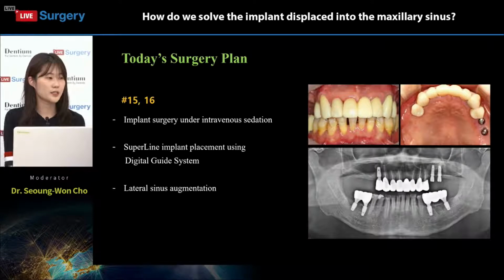So, when it comes to today's surgical plan, Professor Byun will be placing implants for tooth number 16 and 15 under intravenous sedation. In this case, superline implant from Dentium will be used using digital guide system. Sinus augmentation will also be performed.